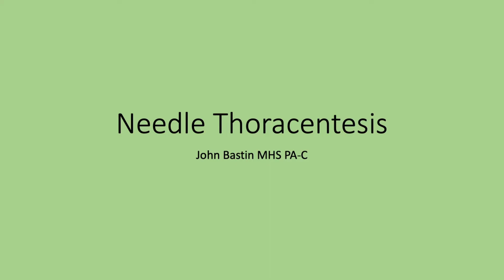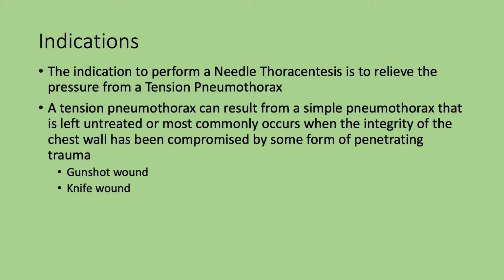Hey class, this is Professor Baston, and today I want to demonstrate how to do a needle thoracentesis or a chest decompression. So the indication for a needle decompression or needle thoracentesis is to relieve the pressure associated with a tension pneumothorax.